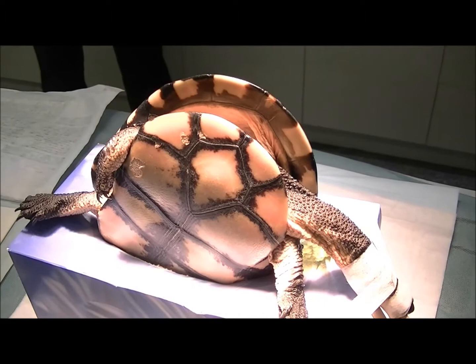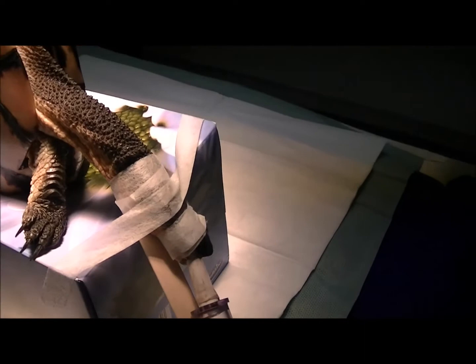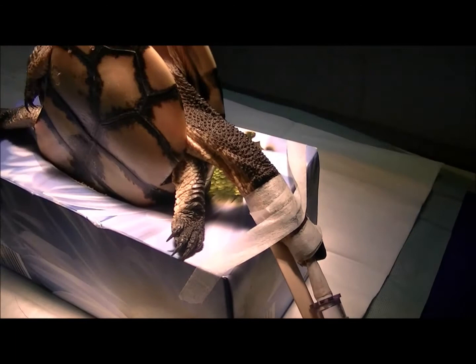Hi everyone, Shane from The Reptile Doctor, and this is an Eastern Long Neck Turtle. As you can see she's been held in a bit of an unusual position — she's actually wedged into an empty tissue box, so her head's here. She's anaesthetised at the moment and we've got her connected to a ventilator because she won't be breathing on her own.